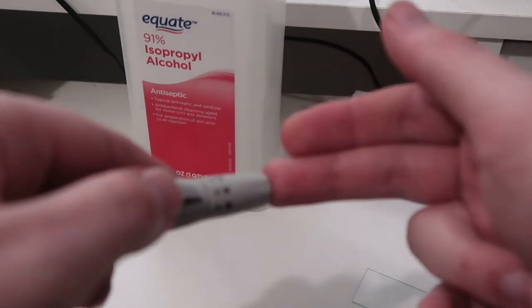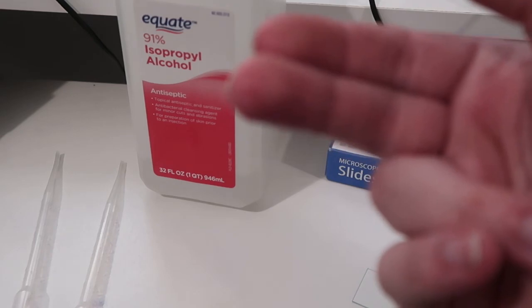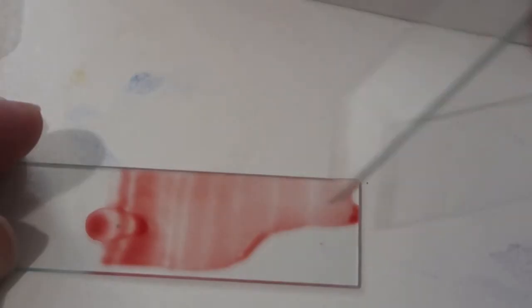in the name of science. Our work isn't even close to being done though. I squeezed out a drop of blood and placed it on the right hand side of my slide. I took the second glass slide and performed a not very good thin blood smear. That's a yikes for me, dog. Make sure you do better.